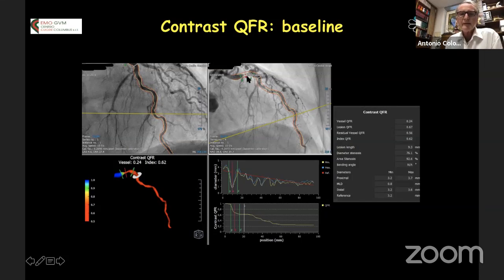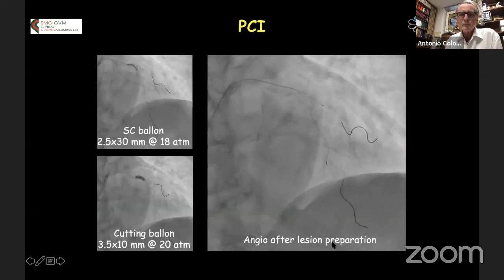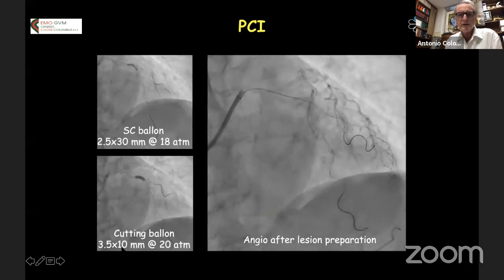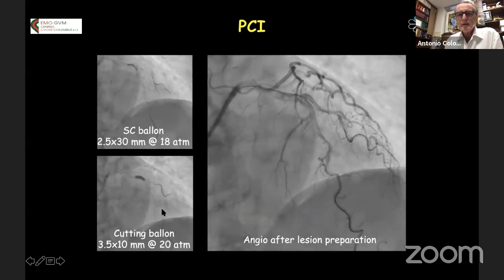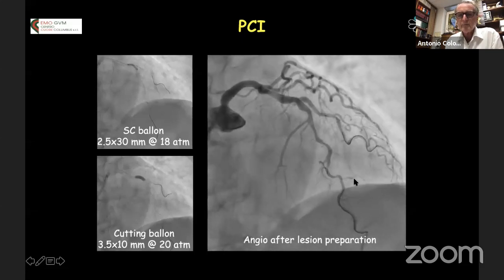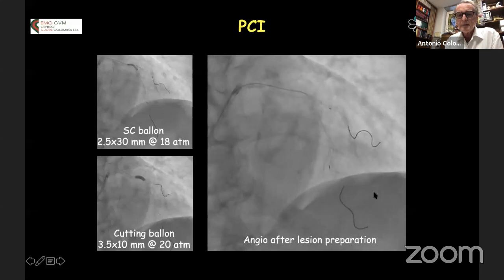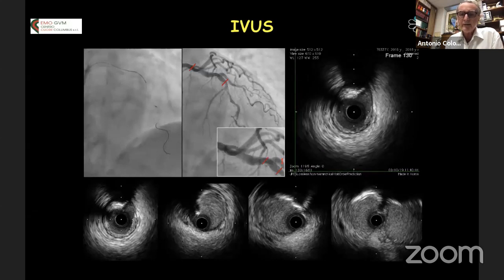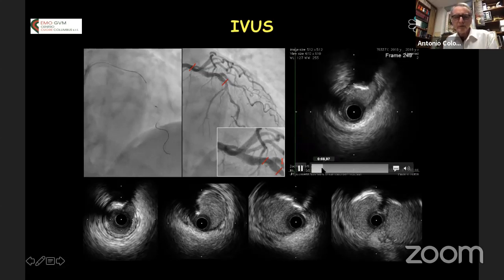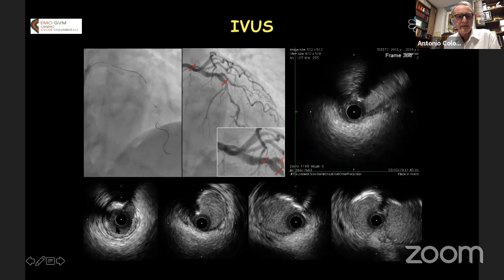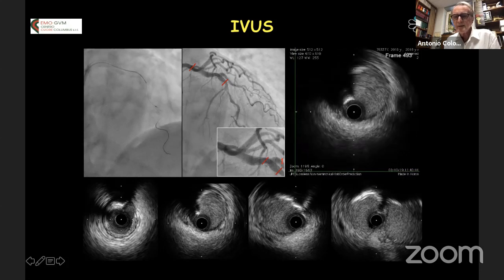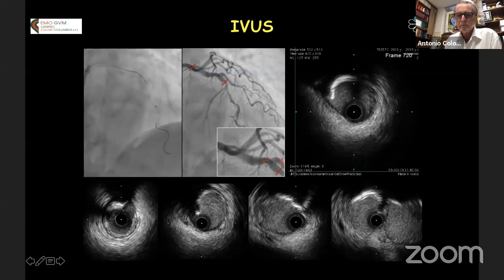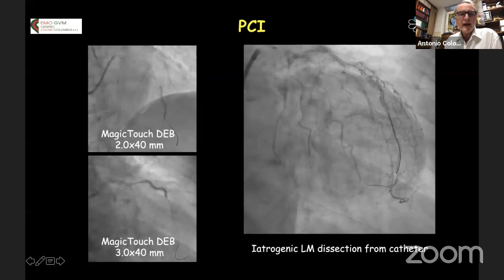You really don't need this test to demonstrate diffuse disease with a severe focal lesion proximally, but it is good documentation. We did balloon angioplasty distally, cutting balloon 3.5 mm with just wire protection of the diagonal branch. There is some dissection in the mid-LAD. We did IVUS to confirm vessel size: distal is 2.5 mm, and the bifurcation area is a real big vessel. After dilatation, the IVUS result looks really good.